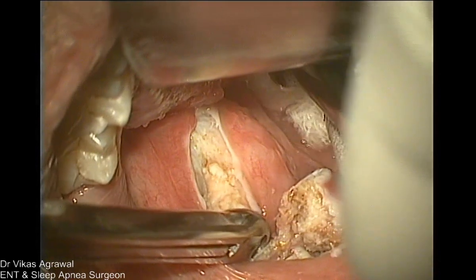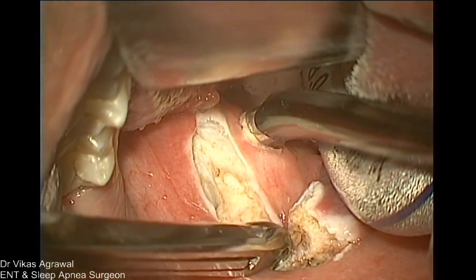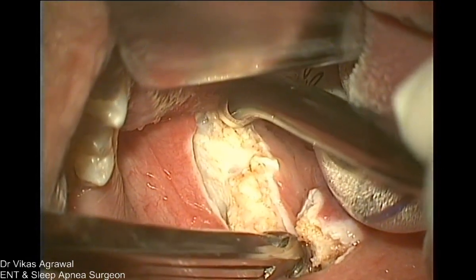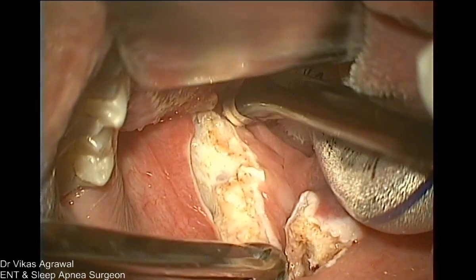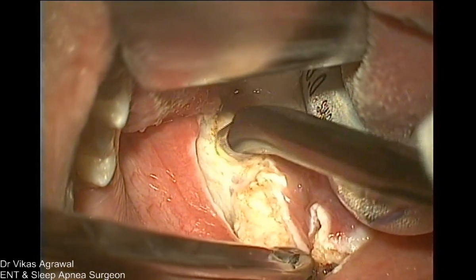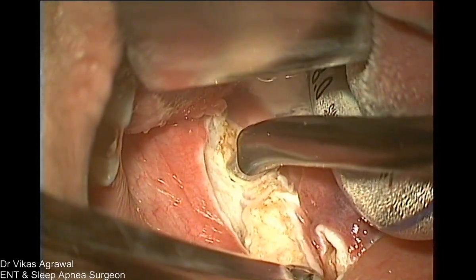So we know that in sleep apnea, the lower pole of the tonsil has almost no role to play. They cannot come close enough to cause sleep apnea. So here I am going intracapsular so that I do not expose the lower pole of the tonsil. And if the tonsillar artery is not exposed, the chances of a secondary bleeding from the tonsillar artery are gone. I have never faced a secondary bleeding from the tonsillar artery in the last 3 years since I changed over to intracapsular surgery at the lower pole.